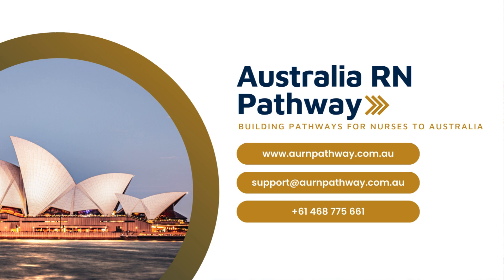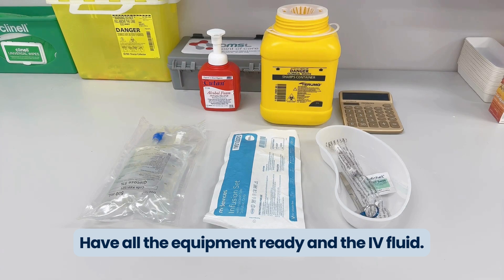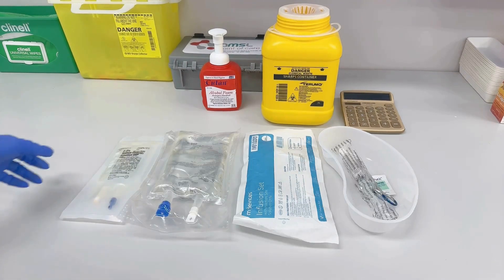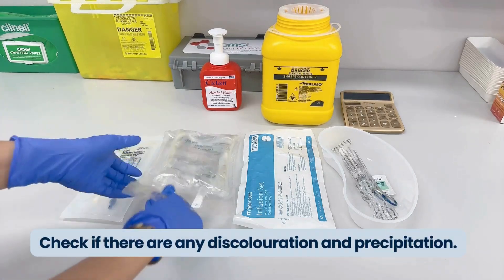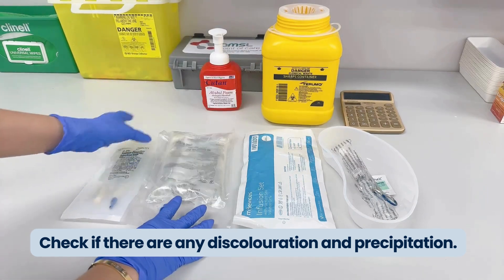To prepare and administer your IV fluid, have all the equipment ready along with the IV fluid. Make sure that you are checking the IV fluid itself — that there are no precipitates or anything unusual in the fluid.